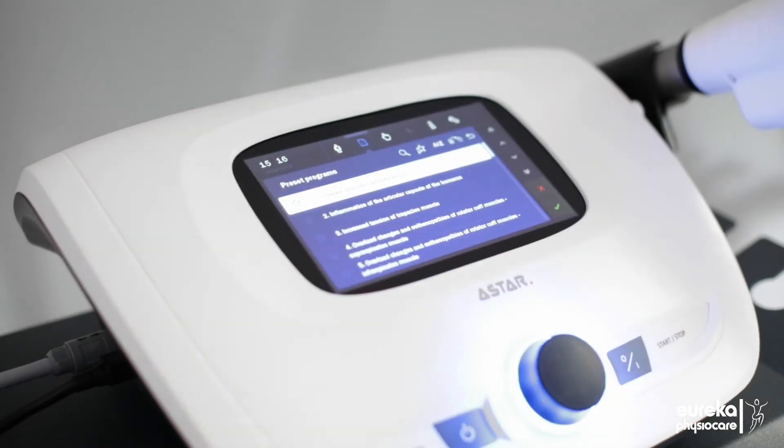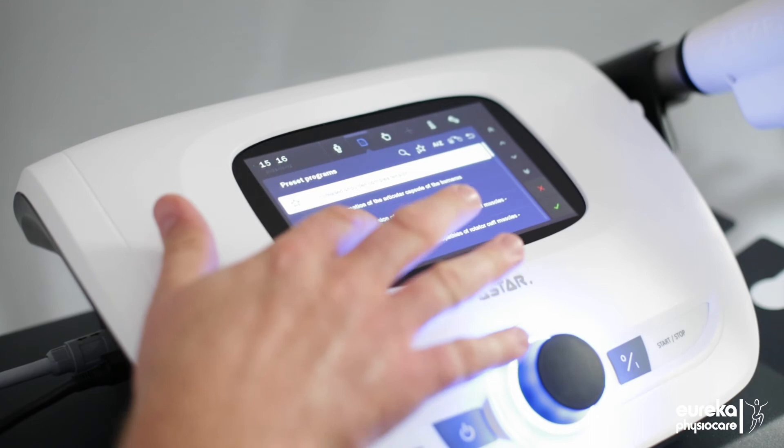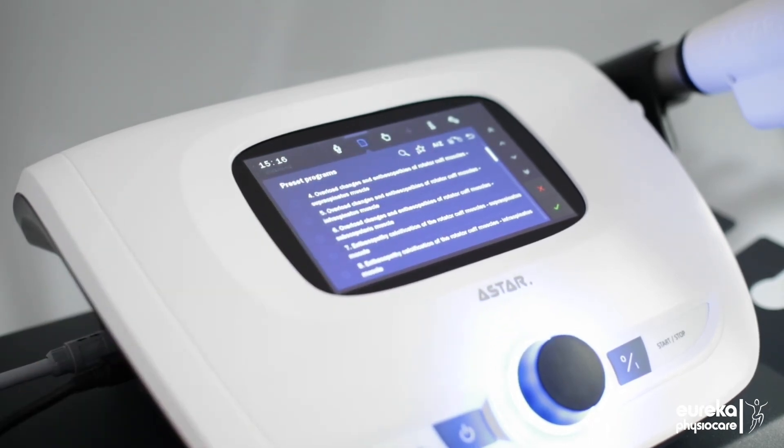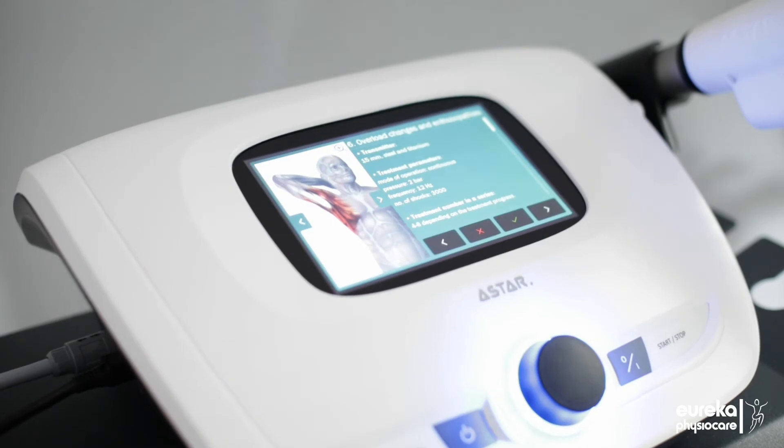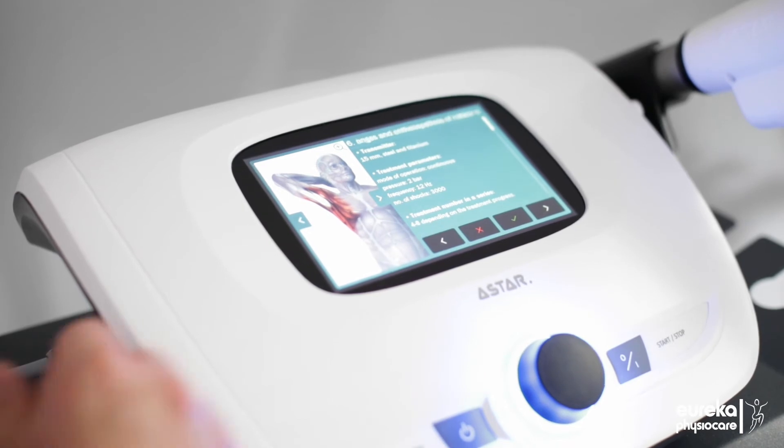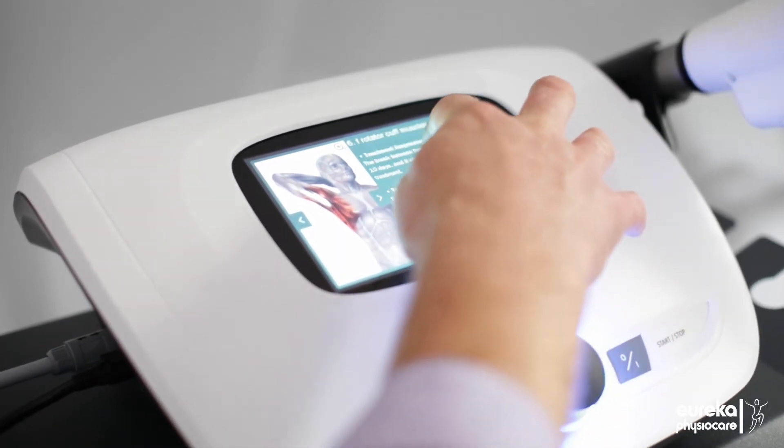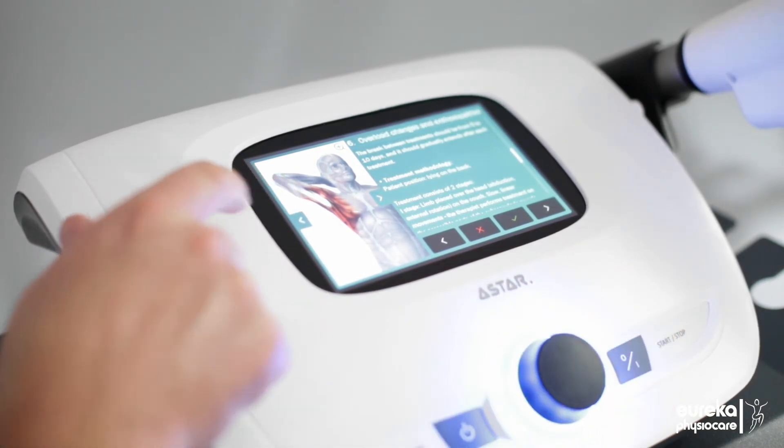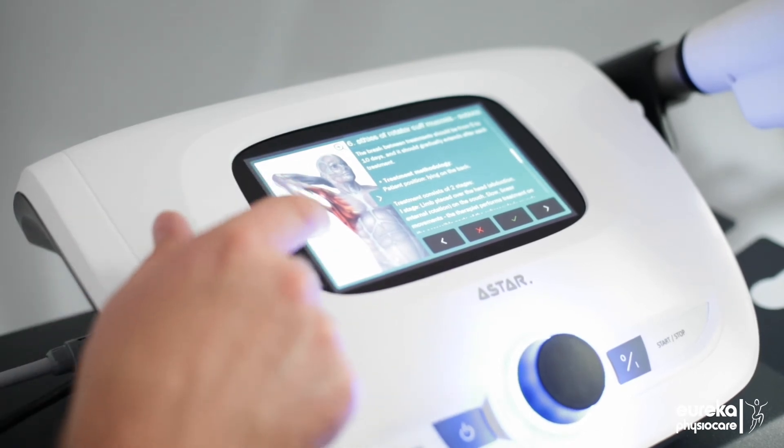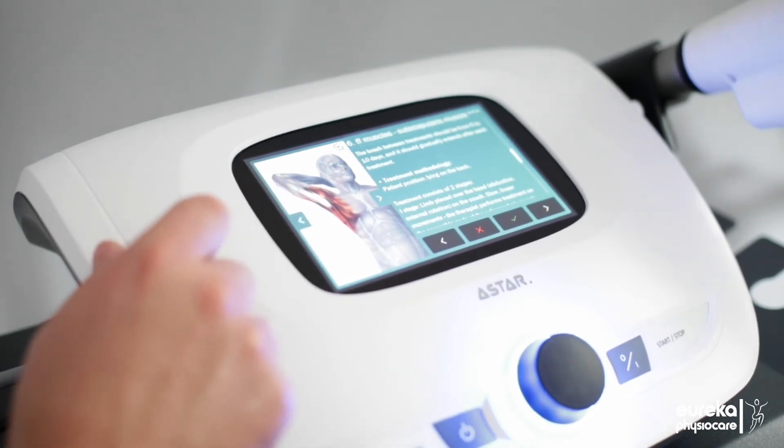So you can see here you've got a very comprehensive list of preset protocols which can be scrolled or searched, and by selecting one of those protocols and selecting the information button, this will load more information on that particular protocol including the treatment parameters, the number of treatments required typically, the methodology, and the treatment head also has a clear diagram showing where the treatment needs to be performed with very clear directional arrows.